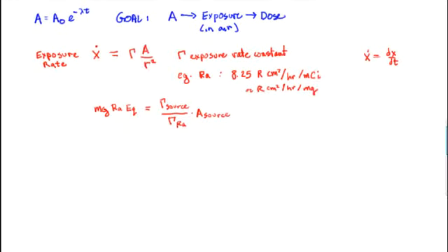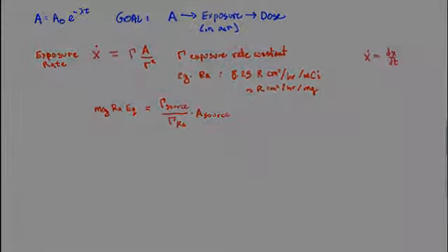So we've got here an expression for exposure, but that's not very useful because we don't deal with exposure in air. What we really want is dose in water or dose in tissue. And so we need a formalism to connect these two together. And I'll walk through that formalism. That's from this report, which is AAPM Task Group number 43, TG43.